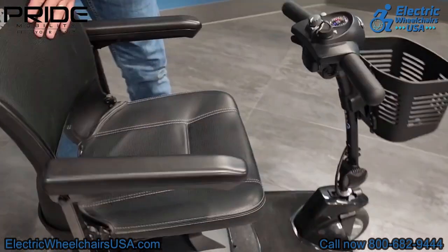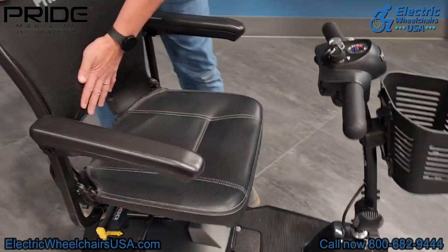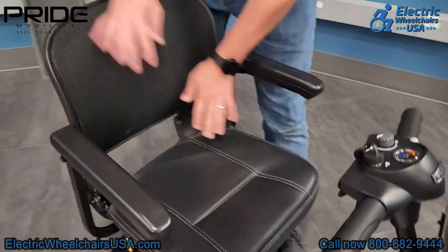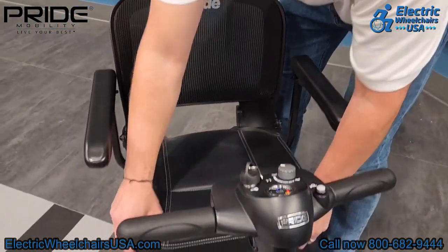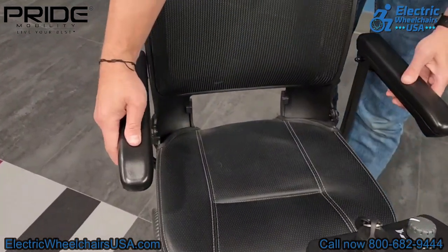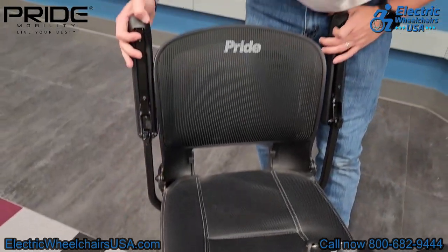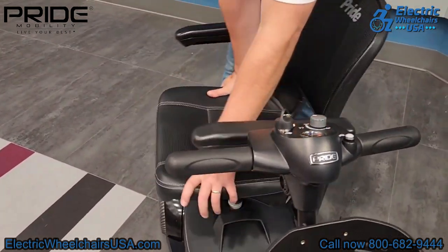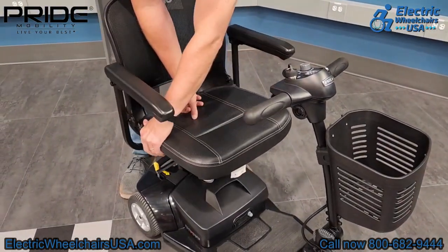The seat on the Ultra X has a mesh back similar to a computer chair and it's contoured, making it very comfortable. The actual seat is padded with a breathable material and nice stitching, similar to a car seat. The armrests have padding as well, and they flip up for easy entry and exit. The seat also swivels 360 degrees, which is great for getting in and out.